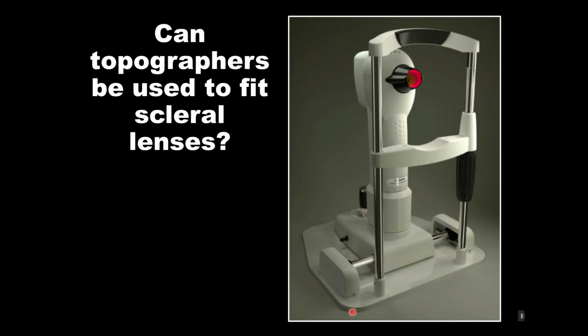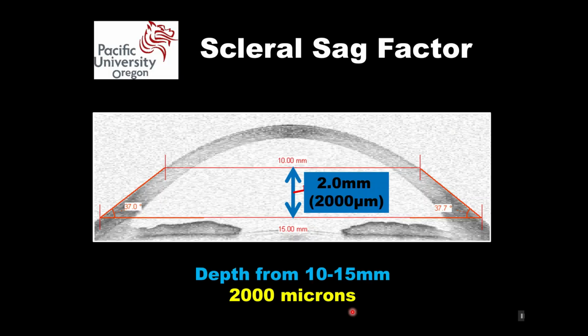Now, could the Medmont be used to fit scleral lenses? And we alluded to this in the beginning. Let's talk about how it can actually be used as a scleral lens fitting tool. Now, one of those things that the corneal topographer can provide is an understanding of the corneal depth.